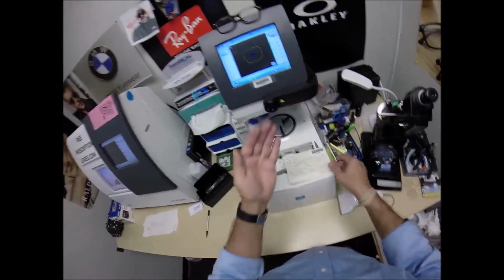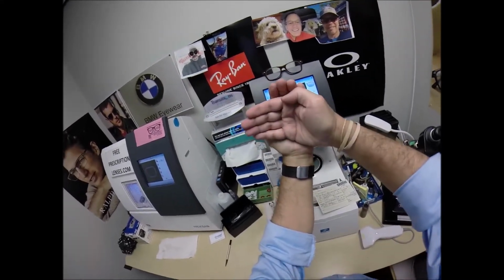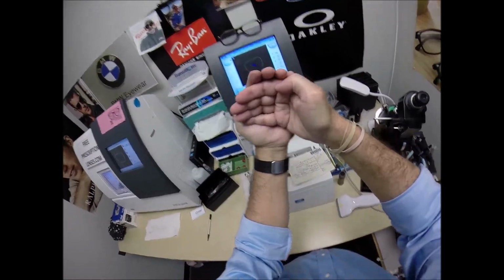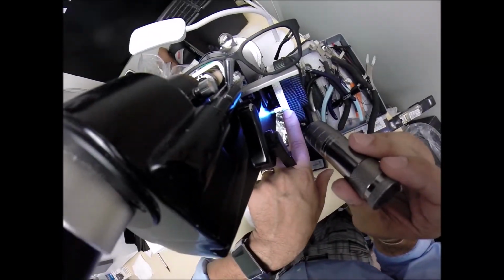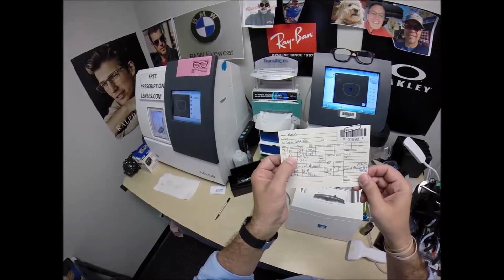Now, you have 2 curves on your eye. You need no magnification or minification this way, but you do need 2.5 diopters, a much steeper curve this way, and it's how we line those 2 curves up to make everything crisp. And we're going to turn that fine-tune knob to 2, which we were at. So let's check the power, and I am getting, on the second curvature, 2.5 diopters, exactly halfway between 2 and 3.